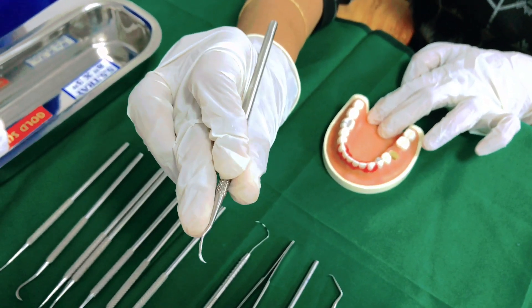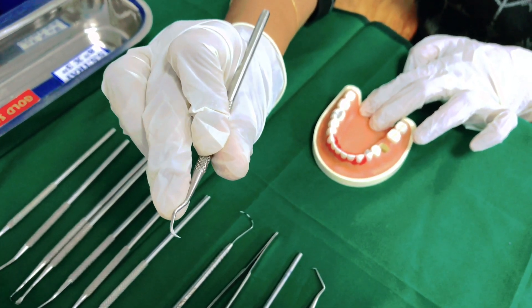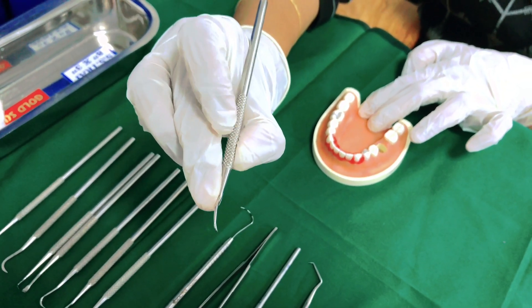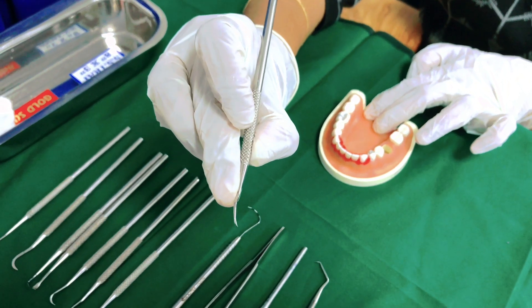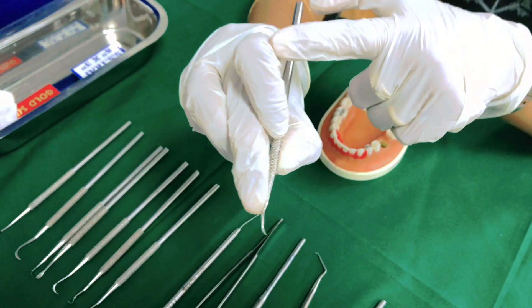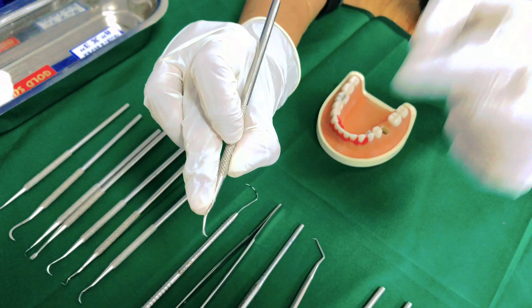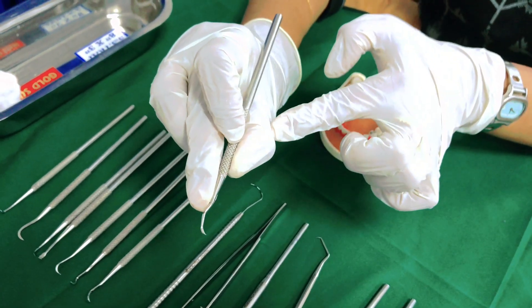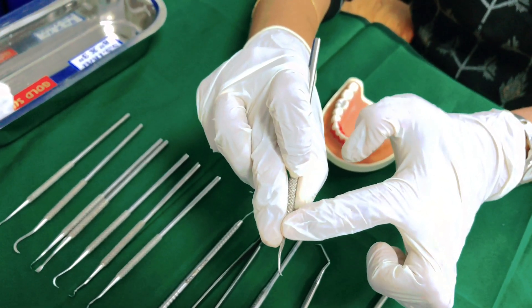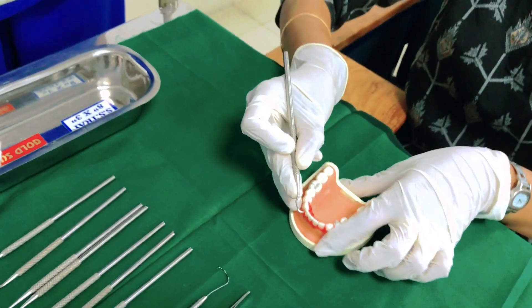Hold your instrument so that your middle finger is towards the terminal shank of the instrument. Your index finger is well above the middle finger, bent at the second joint. Then comes your thumb, which is resting somewhere midway between the middle finger and the index finger. This is how you hold your instrument.